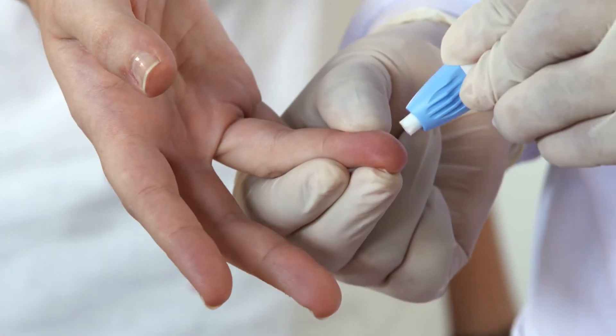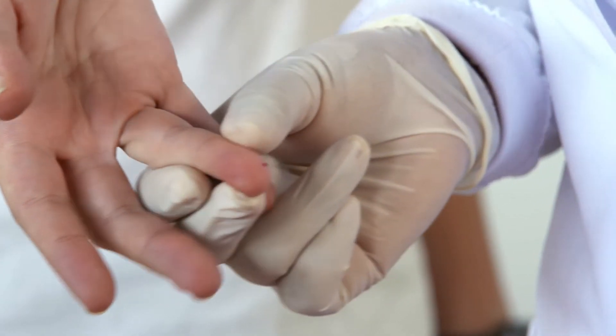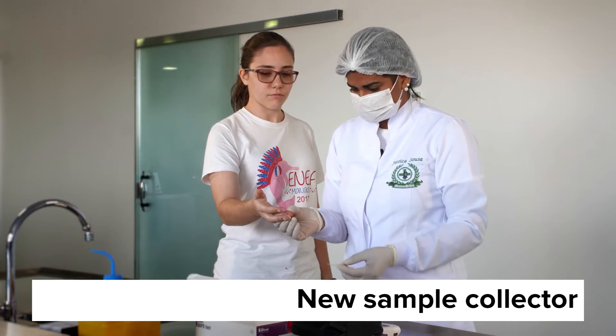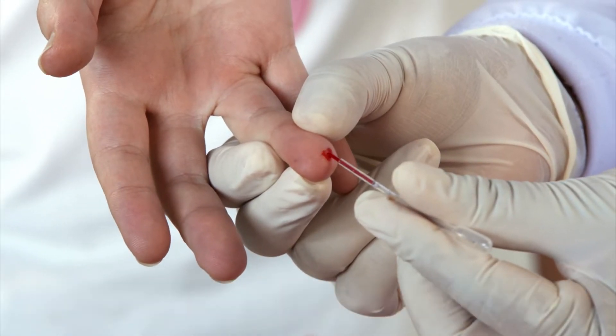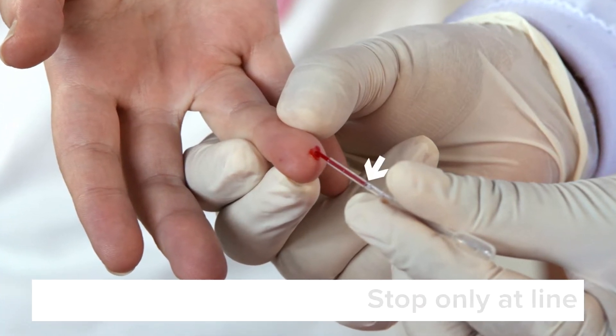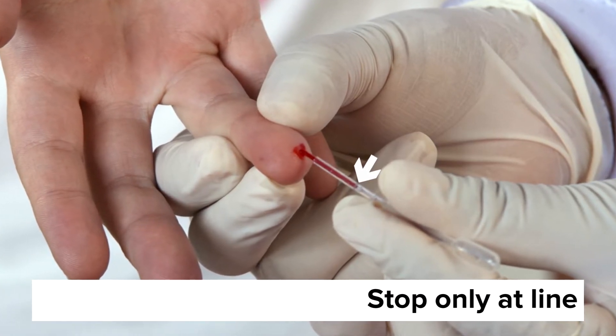For increased sample purity, use the second drop of blood rather than the first. Use a new sample collector, hold it by the stem horizontally and gently touch the tip to the blood drop. Blood will automatically fill the sample collector to the black line. Stop only when it reaches the black line, 10 microliters. It's important to get the right amount of blood.